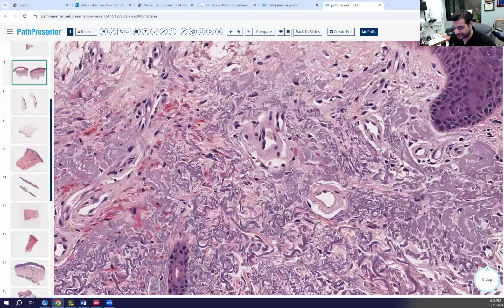What's up with that? Does it have something to do with the uroporphyrin in the vessels? It's activated by light. So you get this eosinophilic hyaline material that's deposited around the vessels in PCT. That's another feature that you've got to look for.